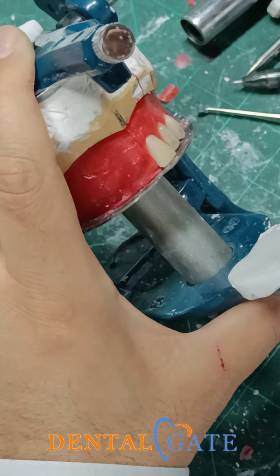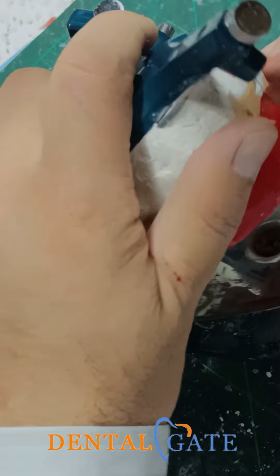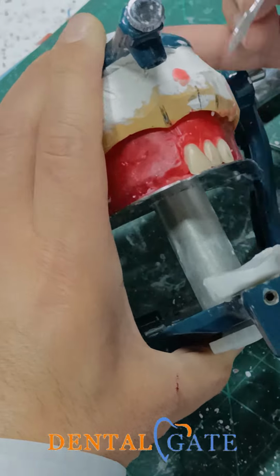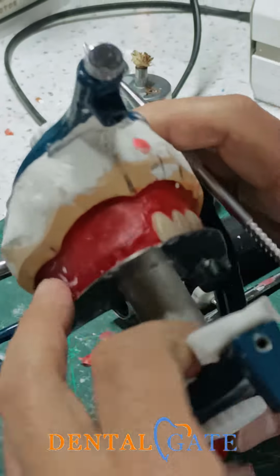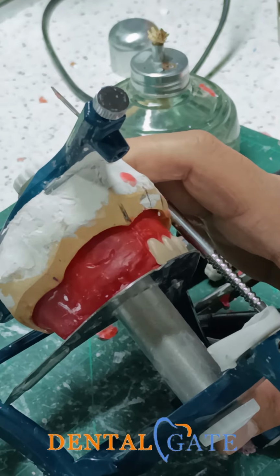Just the lower canine, we can't do it with it. Just keep it within the level and make sure, if you want to make a double check, this is not a movement to be performed. This portion should be prominent, as in the central incisor. When I see it, it is prominent. Okay? Regarding the long axis, it should be parallel to the vertical axis.